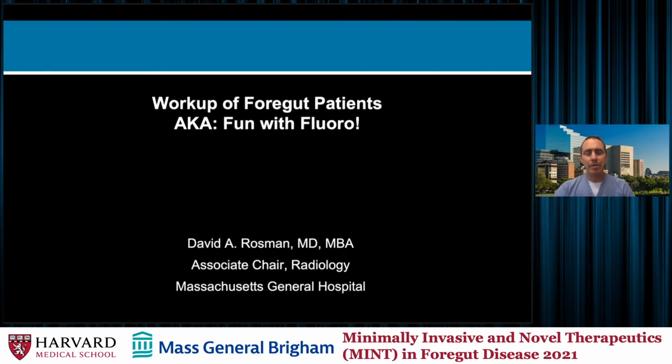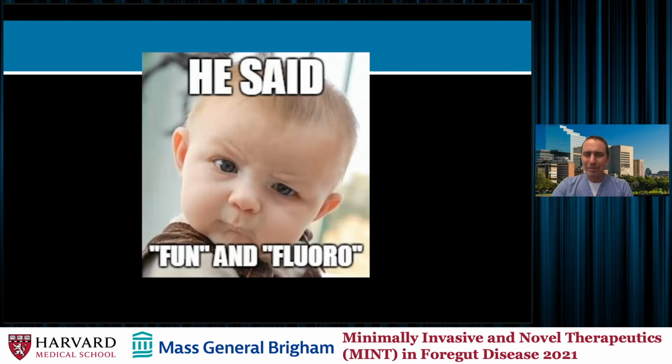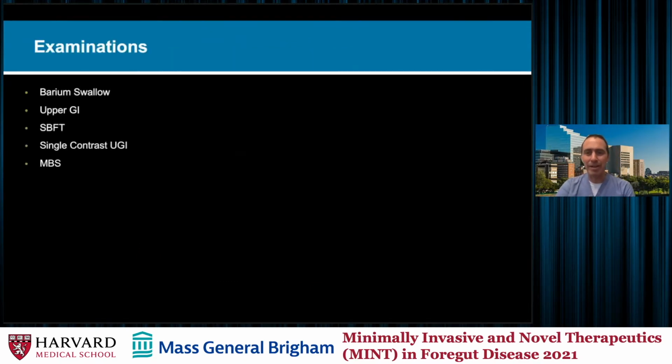So we'll start there. So fun and fluoro, really? Are you kidding? That's at least what my residents think. If it's not CT or MRI, they don't understand why we'd bother.